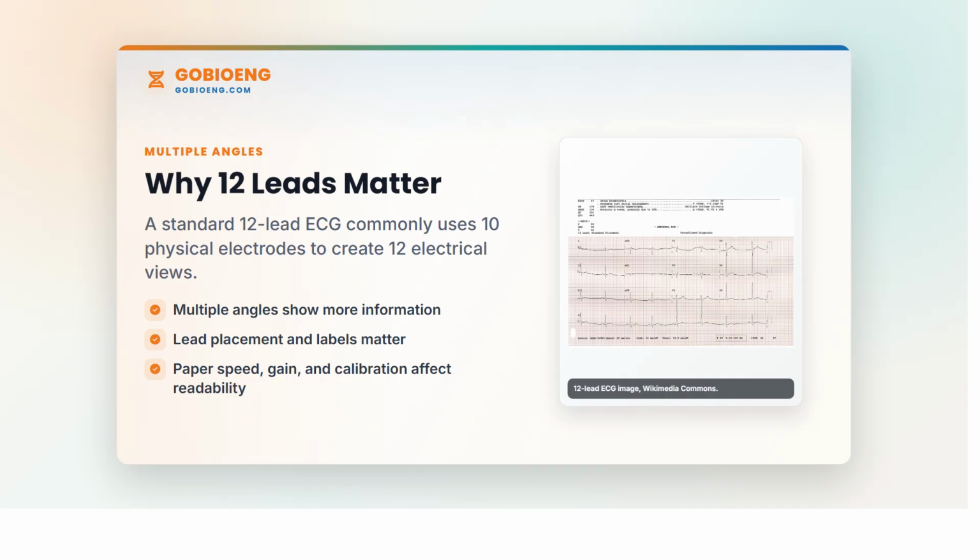Clinically, ECG became everyday medicine because it is fast, non-invasive, relatively low cost, and rich in information. It can help assess arrhythmias, conduction blocks, myocardial infarction patterns, electrolyte-related changes, pacemaker activity, and medication effects. But ECG should not be treated as a standalone answer to every problem. Clinicians interpret it with symptoms, history, examination, blood tests, imaging, and the wider clinical context. For biomedical engineers, that matters. A device produces data, but medicine uses evidence in context.